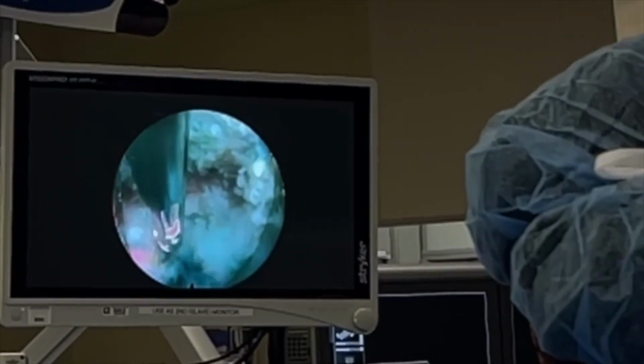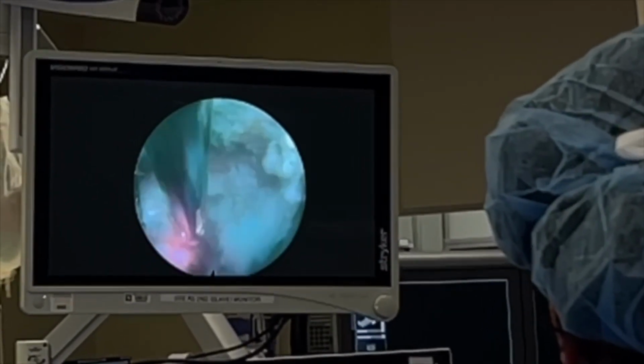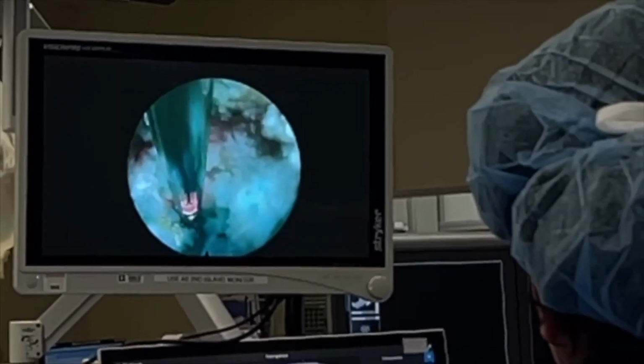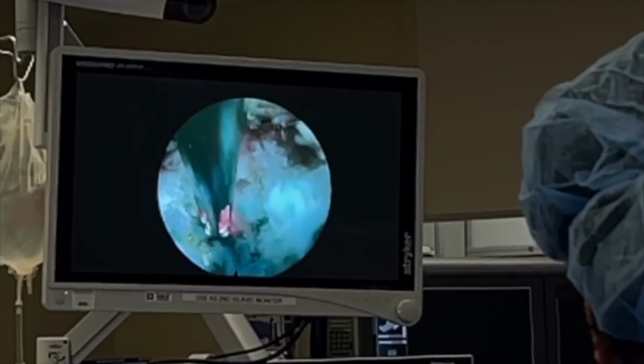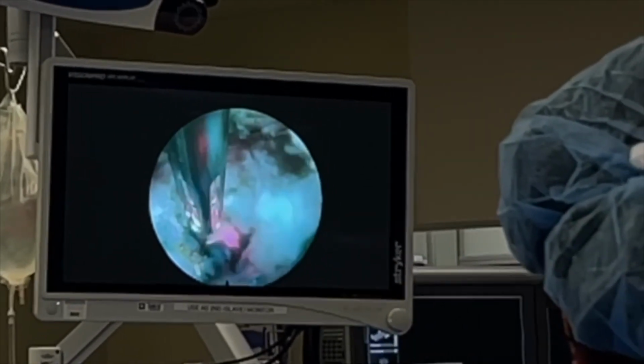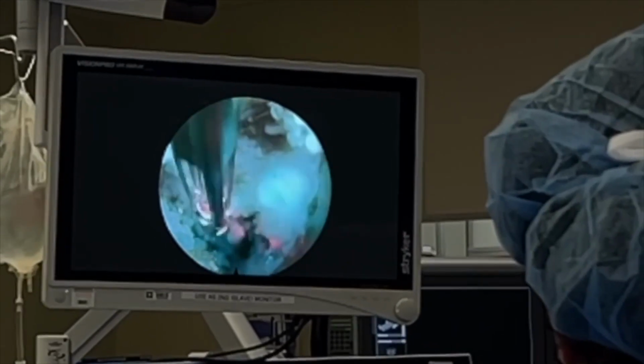And two, it is not electrical. It's mechanical. Isn't that wild? So it will not electrocute the nerve if it's right next to it. And there are times when the nerve is so close that I can't use the Trigger Flex probe, which is essentially a radio frequency electrical bipolar probe.